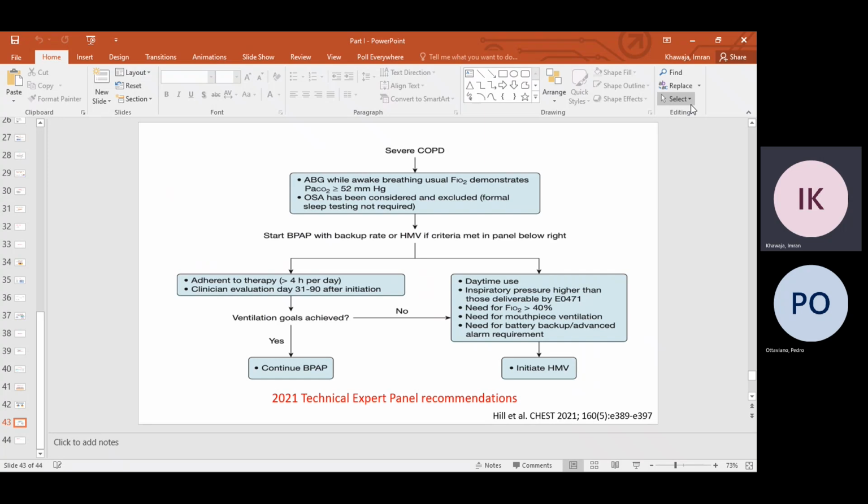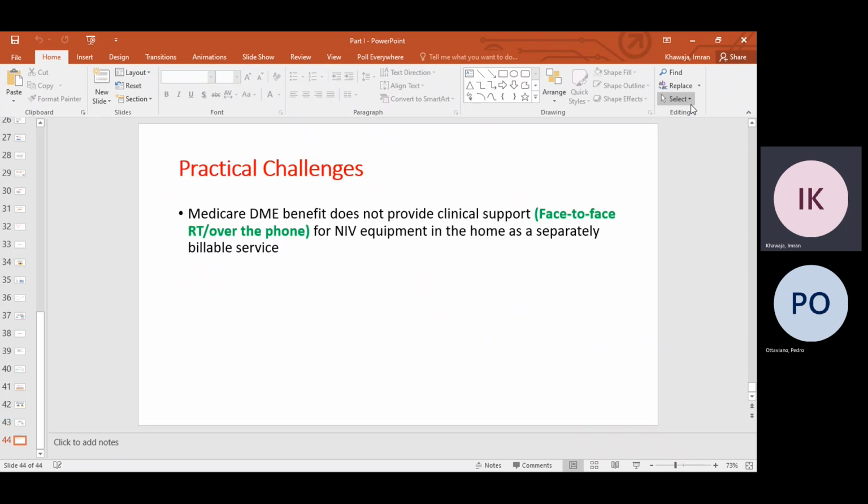We don't do that. I used to send my patients for sleep studies, and I realized that technicians don't really know how to titrate a BiPAP for sleep apnea. No, just for sleep apnea. They don't know how to titrate it for CO2 for COPD management. So I started not doing that. Now I use the AVAPS most often, or if they're already on a machine, I check frequent ABGs, not even just tidal volumes, because again, you want to unload them. You don't know if you're unloading them or not because you don't have an esophageal monitor. So I check CO2s and maybe blindly make changes accordingly every few months, or use an AVAPS machine.